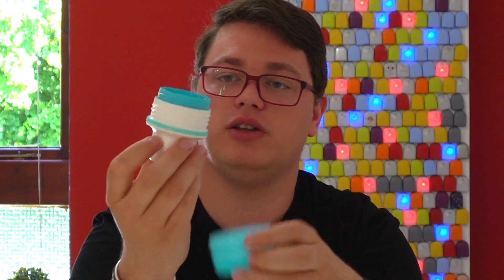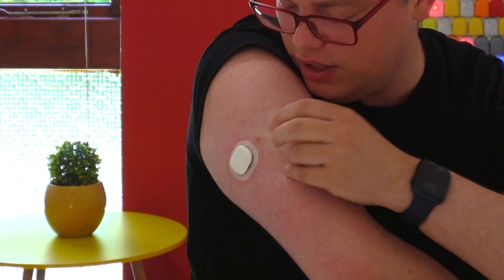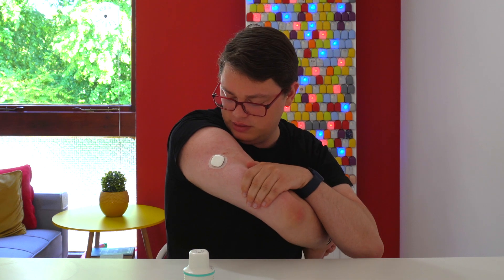I've got Omnipod and Dexcom G7 on here, so I'm going to apply it on that arm. With the Simplera, we just rotate and you can see it. You put it on — 3, 2, 1 — and there we go. You can observe the rather interesting adhesive they've done with the Simplera, with the grid pattern, which is very interesting.